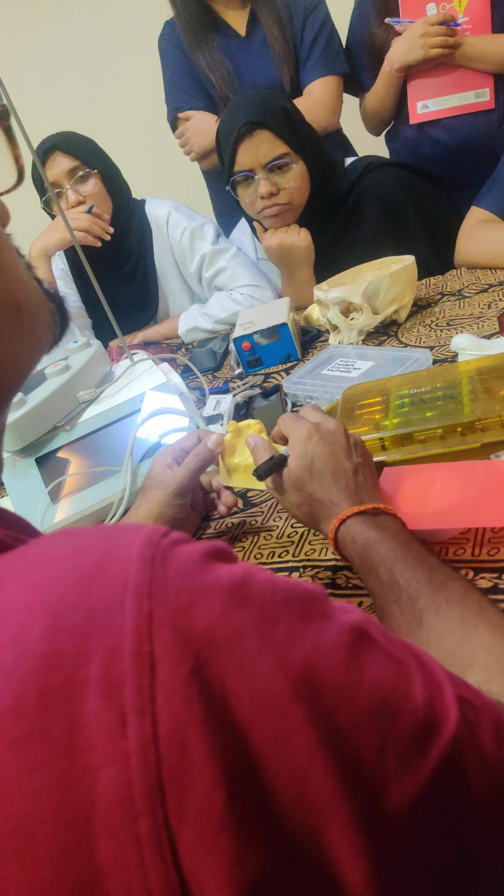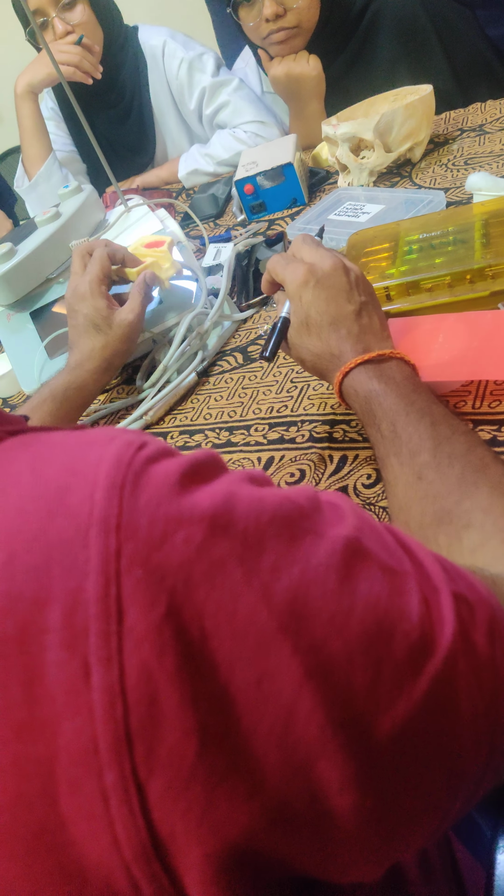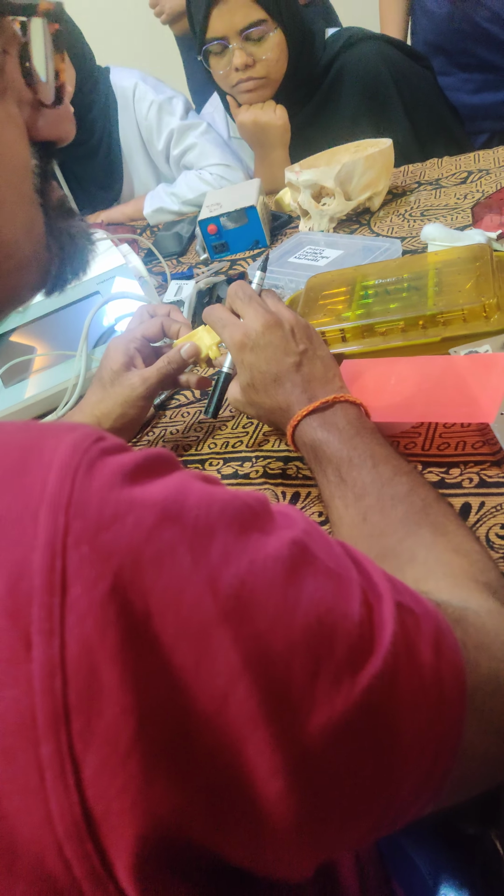Sinus. Here in this model I don't know anything. And secondly, this is a very wrong anatomical model. It's not a right model for sinus lift, but we don't get any other models apart from this. So just to make you understand, I am going to use this.